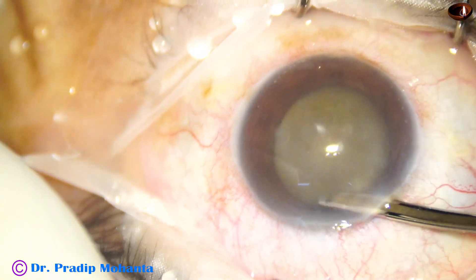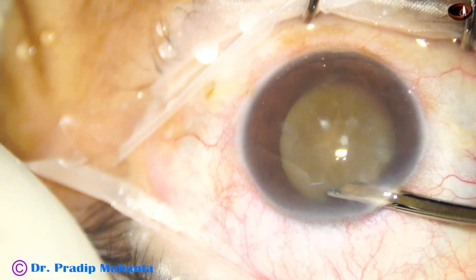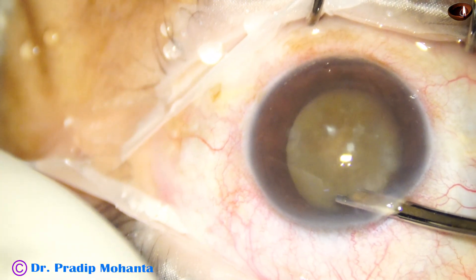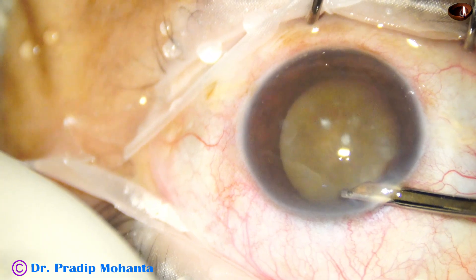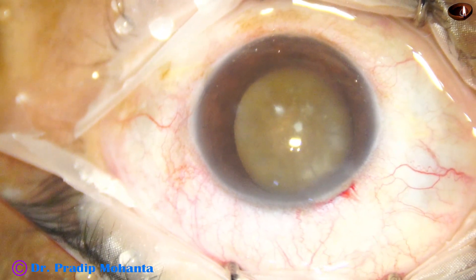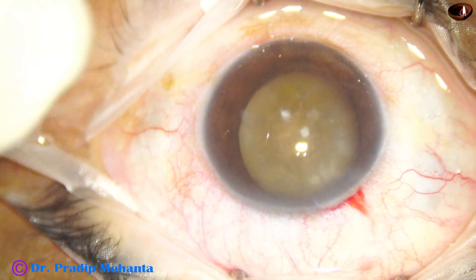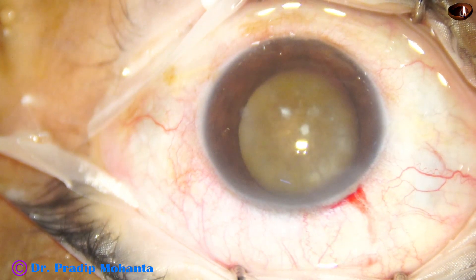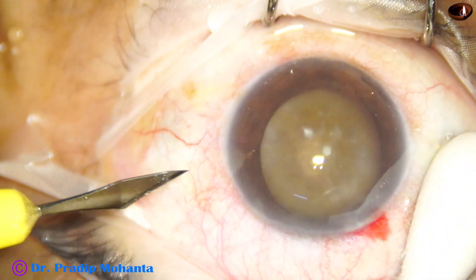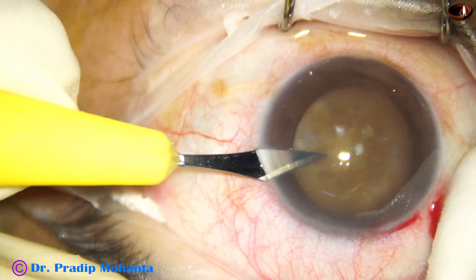After making the main incision, I irrigate and aspirate the anterior chamber. I can now see the iris details. We can see a mature cataract and the nucleus is very hard. A side port is made on the left side of the main incision, about 3 o'clock hours away.